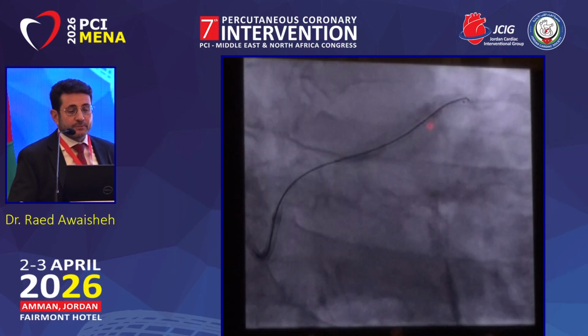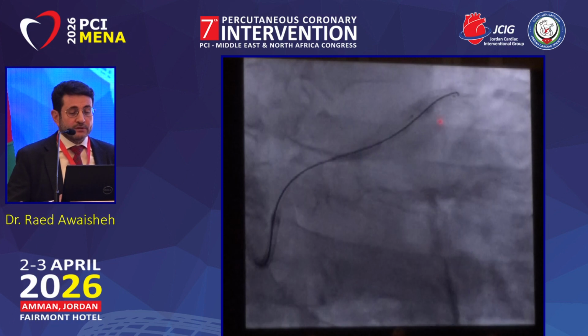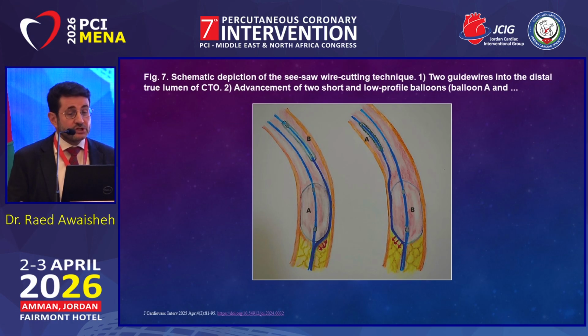You can see here you have a balloon, and this is what I inflate to fix the Miracle 12 and fix it there. So I'd be able to go with the other balloon here and inside the calcium and crush it from inside. And after that, as you see here, we go with the seesaw technique.